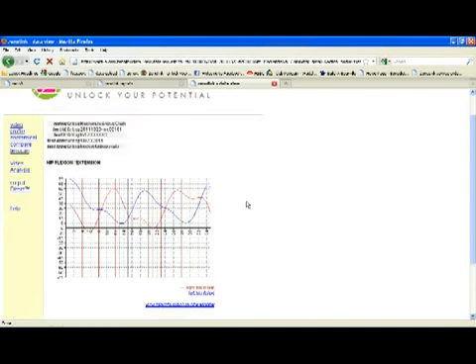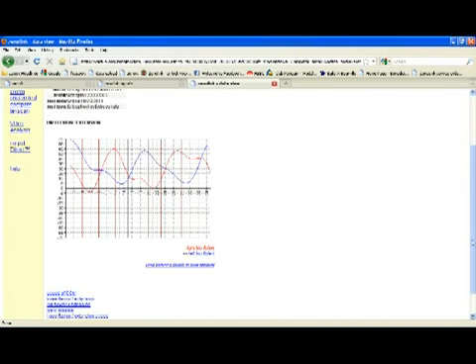When we look at hip flexion, now on this side we see pretty good symmetry on flexion at the hip, but some limitation on the left side hip. So we've got some range of motion limitation, right side knee and left side hip, to go with a breakdown primarily in knee and hip push, limited speed output, but also breakdown in coordination.